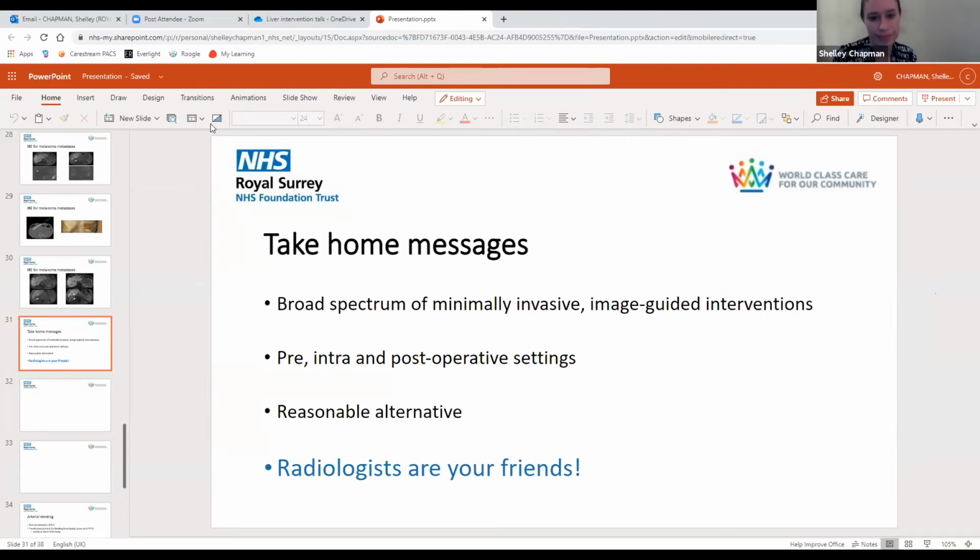Generally CT. And does contrast-enhanced ultrasound have any place in ablation and IRE techniques, do you think? Not for me. I think it is helpful, but the microbubbles don't last forever. It's great for diagnostics and looking at enhancement patterns. For the duration of an ablation, I'm not sure it would help me particularly. Yeah, it's something that we've started doing a bit more of, particularly when the liver's fatty, because like you say, the fattiness attenuates the beam a lot.